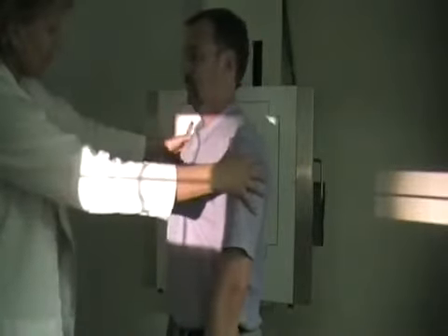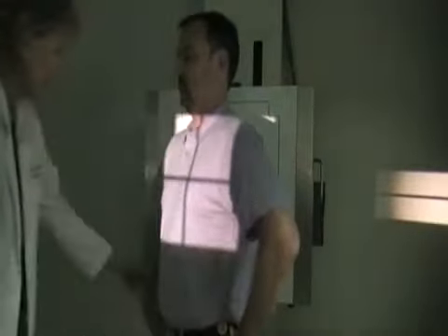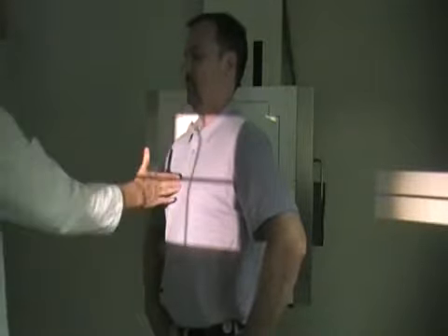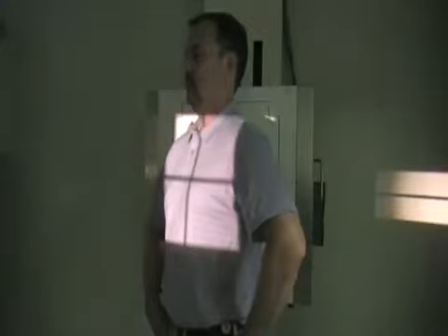Okay, and then I'm going to readjust, lean David just a little bit forward so that we can make sure that we are getting both sides of the lungs on. So you want to check your light field, and it's going to look like this, longitudinal light is on the upside from the midpoint of the chest. But it's real important we do include both lungs on this. So AP oblique is the more common oblique you'll be seeing.